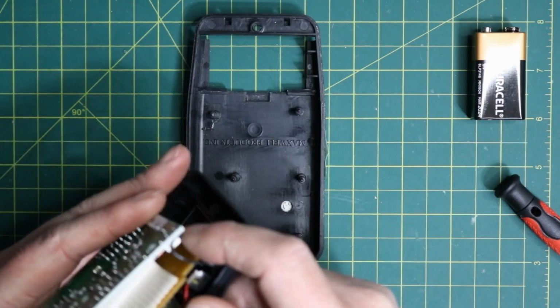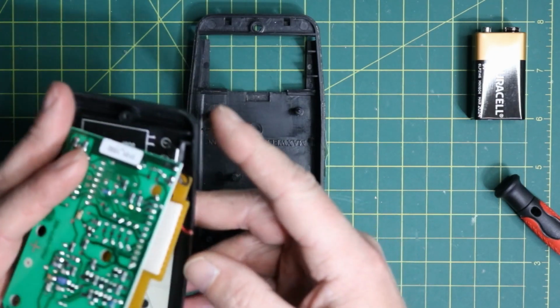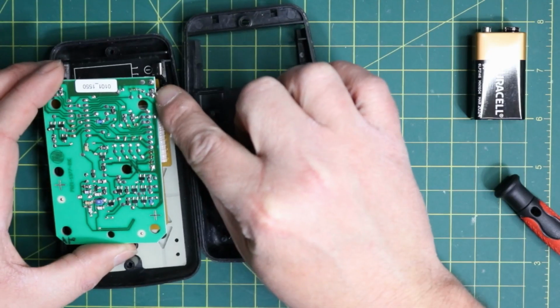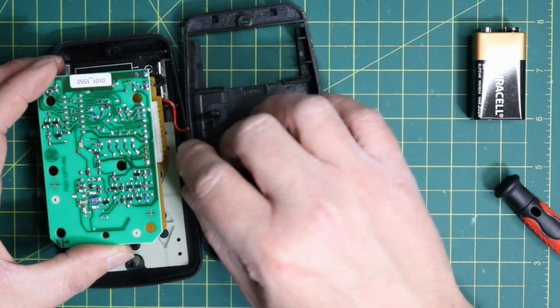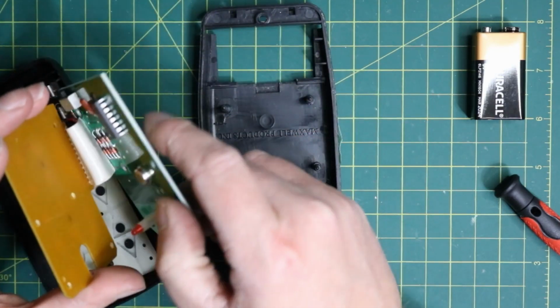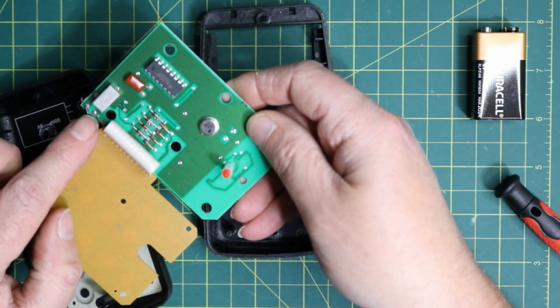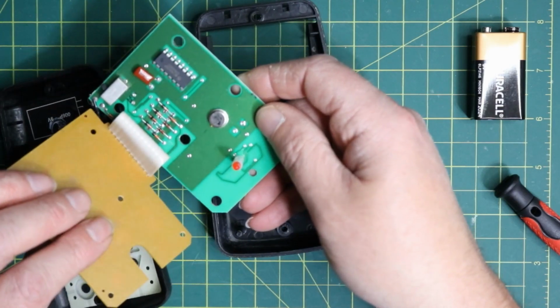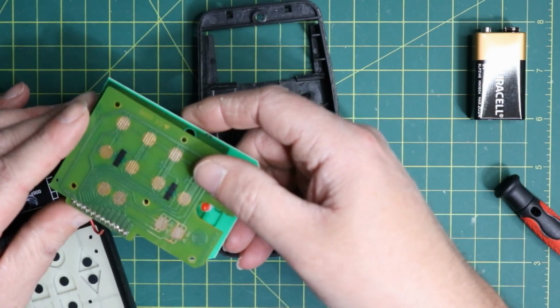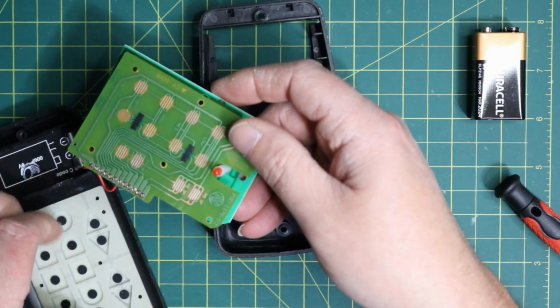But I'm going to take it from the inside of the board and resolder it to the outer side of the board there on the bottom. So I think that should do the trick to get that back going. So right here, that's where we're going to resolder it to. And then that way it'll kind of keep it away from the board, and we shouldn't have any issues. We wouldn't have an issue resoldering to this side of the board either, but I want to make sure that that doesn't come off again if I do have to open it up. So we'll just go ahead and do it on the other side of the board.